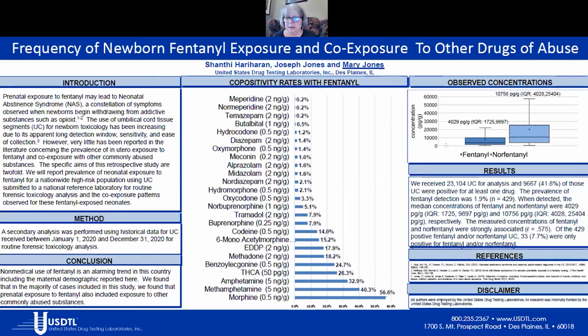In development, the cutoff that we have determined is challenged. Our accrediting agencies have criteria that they've established for method development, and it's really a rigorous process. Not only do we challenge the cutoff, but we also have to challenge 40% below the cutoff in order to have a cutoff at 200 picograms per gram. We had to challenge that at 80 picograms per gram. And that will allow us to, day in, day out, accurately detect fentanyl at 200 picograms per gram.